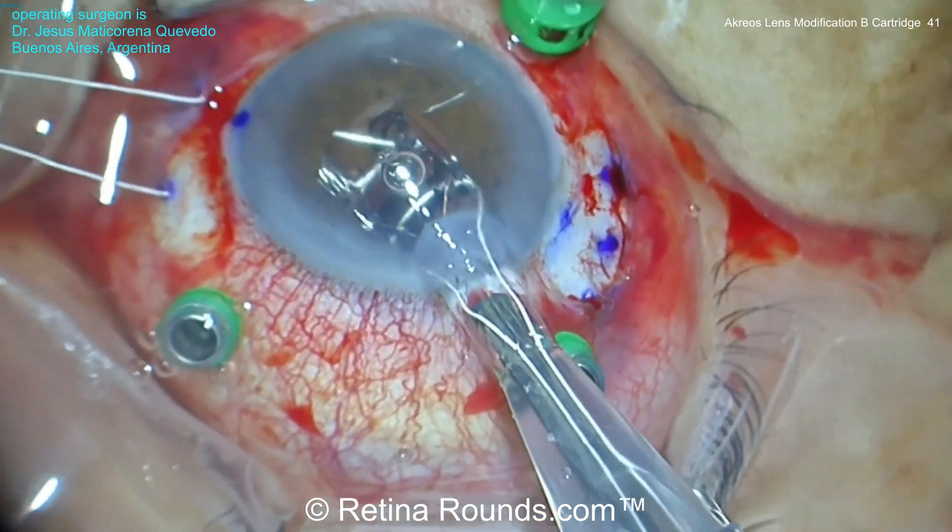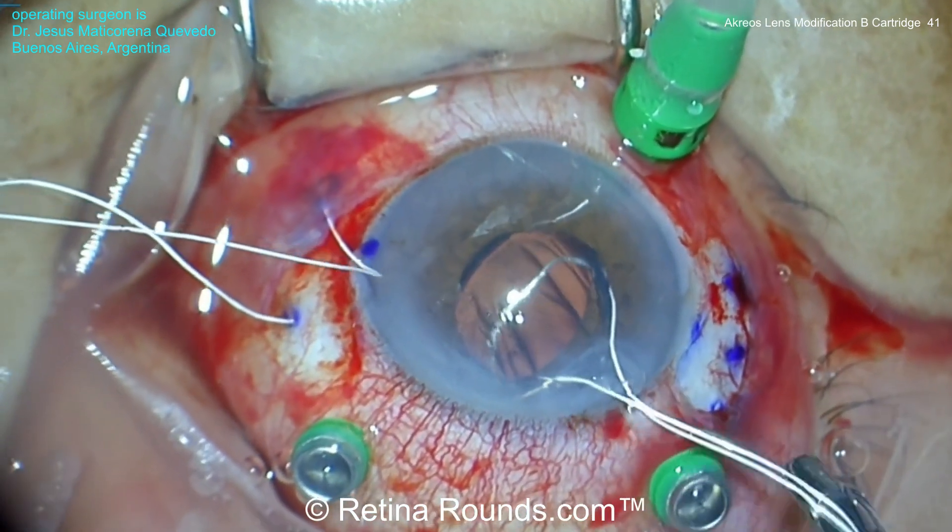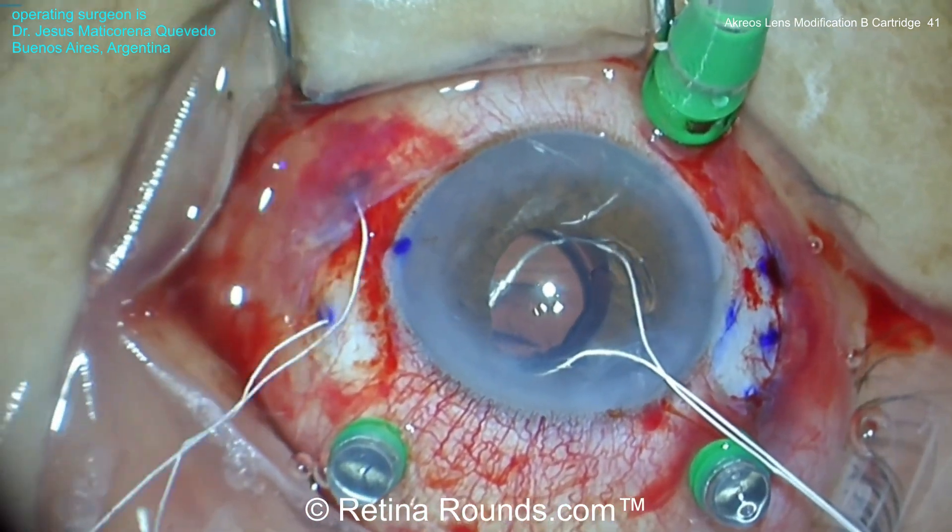The B cartridge is then introduced into the anterior chamber through a clear corneal wound and the intraocular lens is then implanted into the posterior segment.